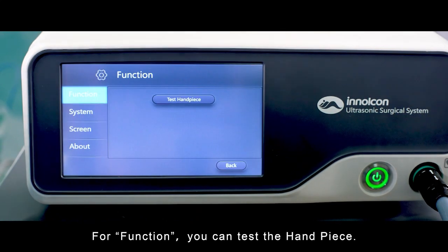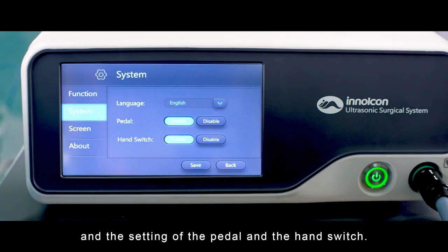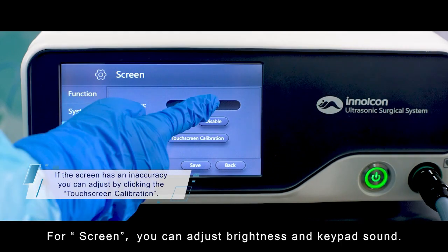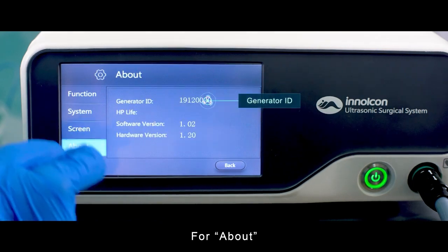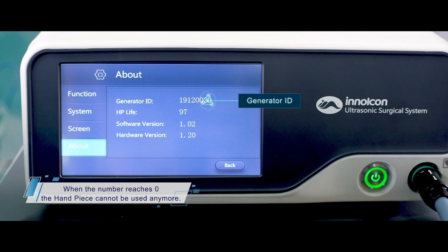For function, you can test the handpiece. For system, you can adjust language and the setting of the pedal and the hand switch. For screen, you can adjust brightness and keypad sound. For about, you can check generator ID and handpiece lifetime.